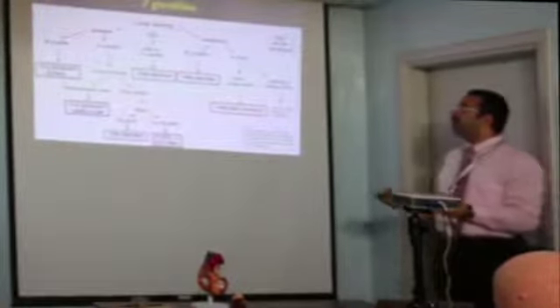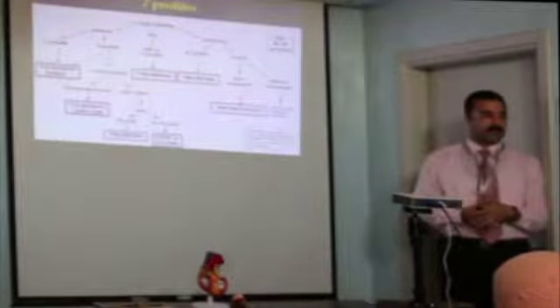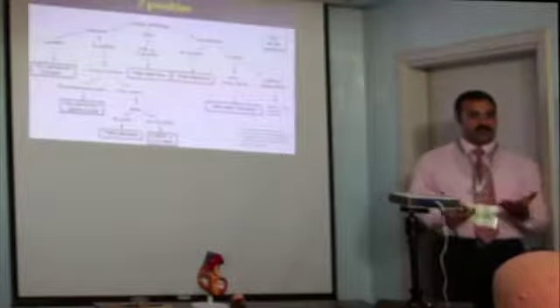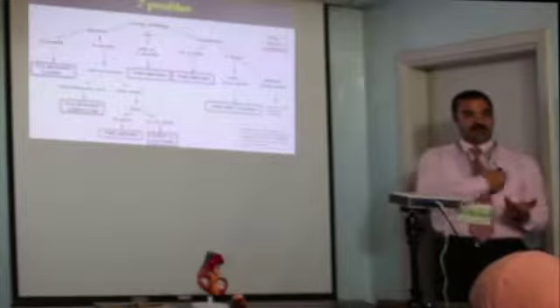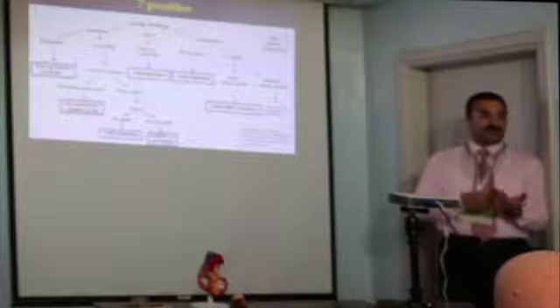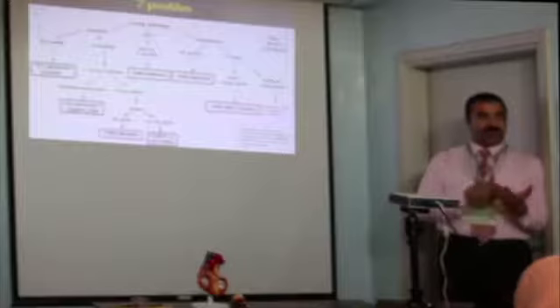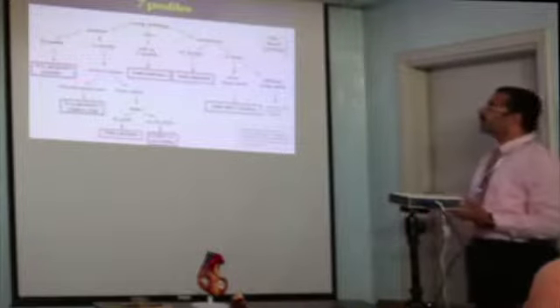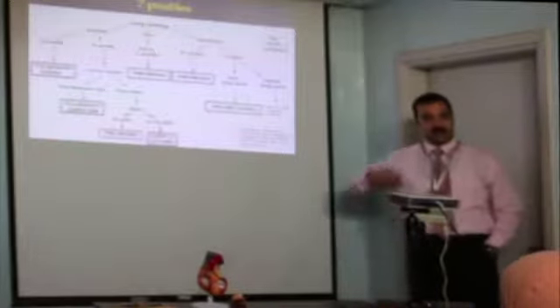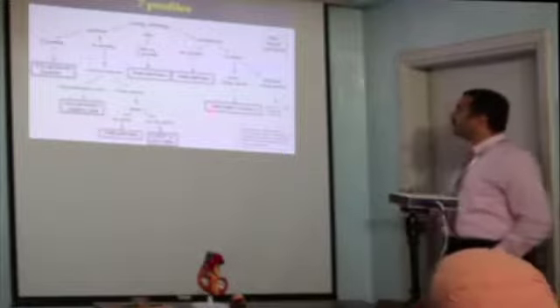Back to the pulmonary edema, you diagnose the B profile. What to do next? What is the cause? Is it cardiomyopathy, poor left ventricular ejection fraction, a new regional wall motion abnormality, severe mitral regurgitation? What is the underlying cause? So always, after you finish the BLUE protocol, if you find a diagnosis, go and assess to complete the puzzle. So till this point is clear.